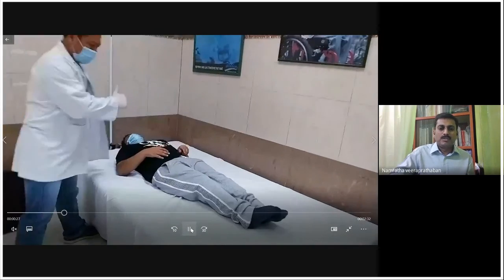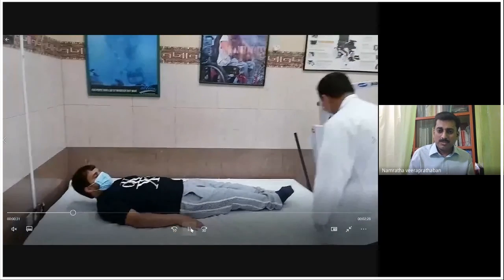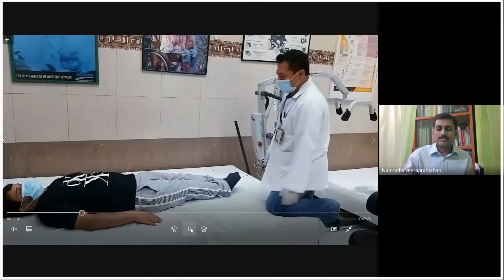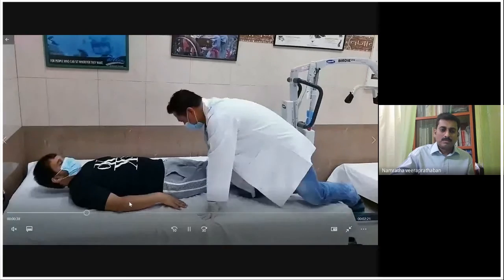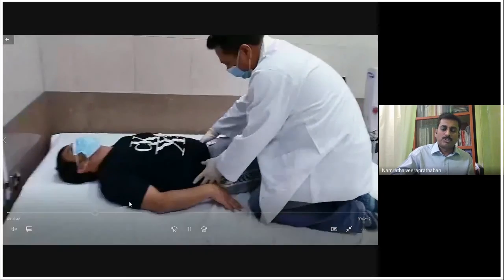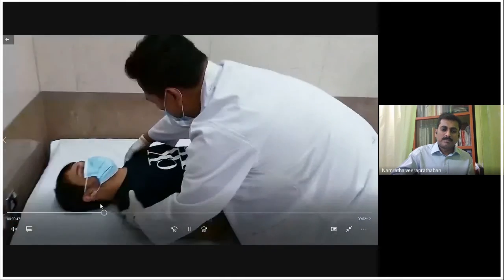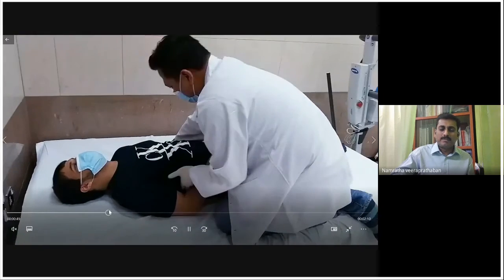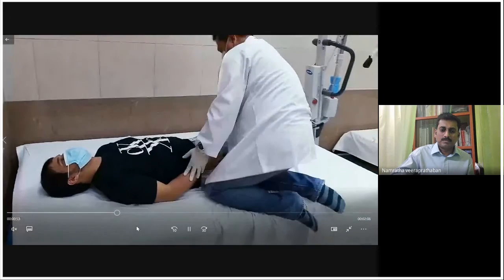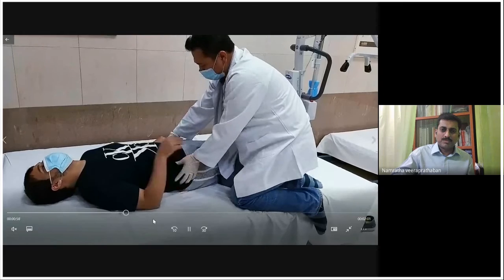Okay. The therapist is going to do a supine evaluation. He is one of my colleagues, actually, who works closely with me. His name is Mr. Harris. As I said, in the evaluation we first go and check the pelvic. The pelvic is the key. He's checking the spine. He's checking for scoliosis and kyphosis. He's trying to palpate the ASIS.